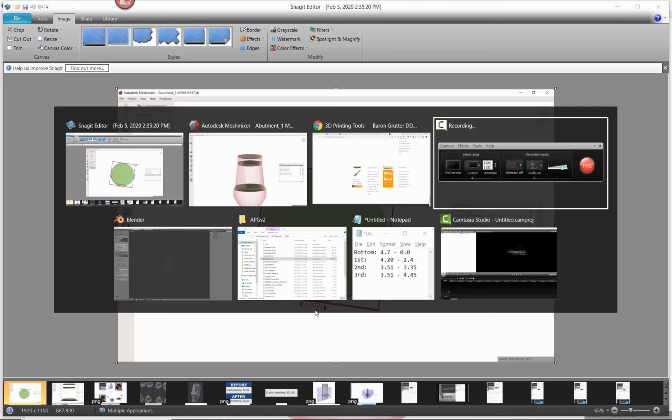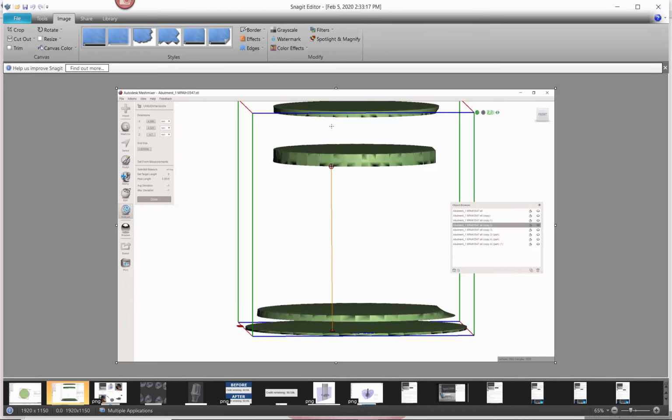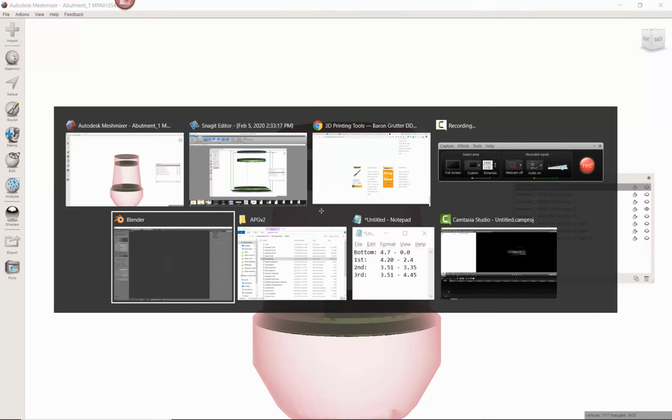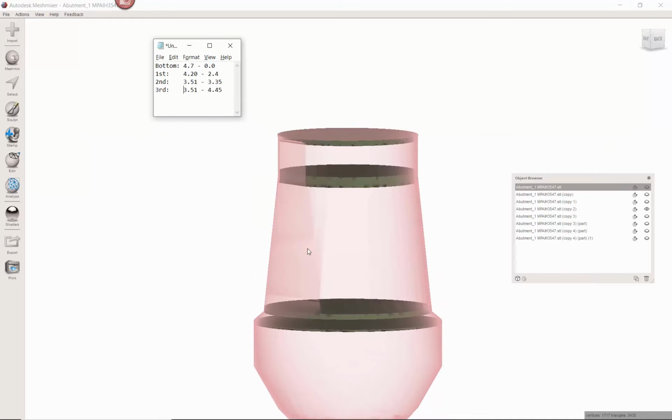And then for the height, I measured the distance from one layer to the next and whatnot, okay? So in this case, it was 3.35 millimeters. And so I created, let's get back to this, and let's bring up this chart. So what this chart is showing is that at this bottom layer, it is 4.7 millimeters in diameter, and it's a zero height because it's the start point.